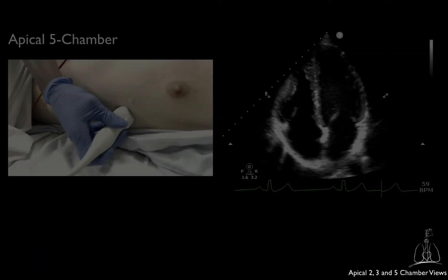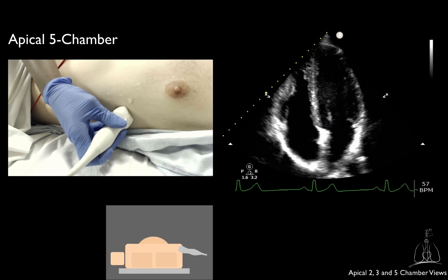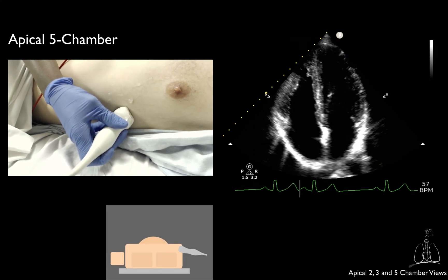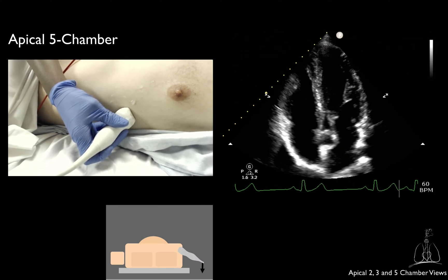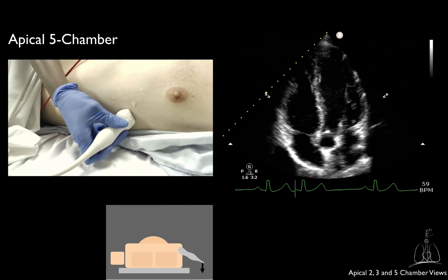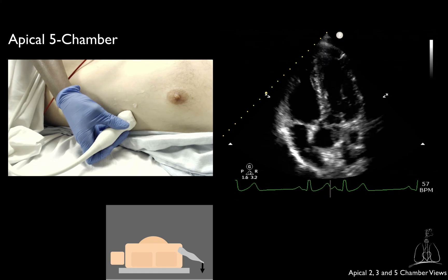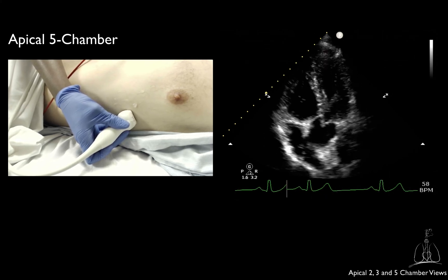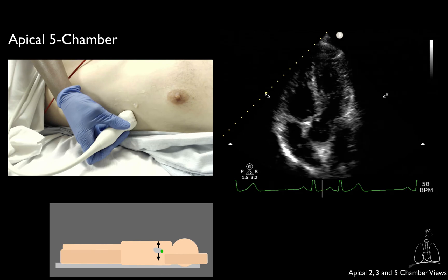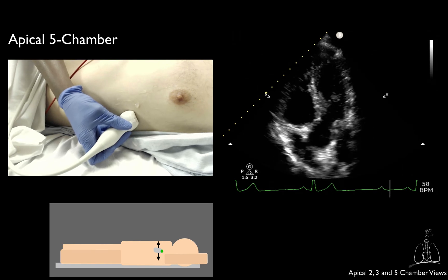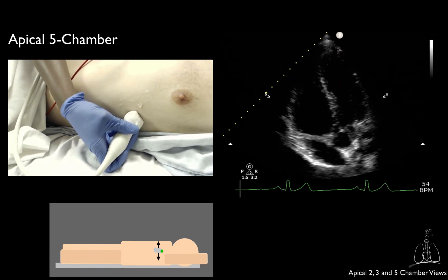To obtain the apical 5 chamber view, start from the apical 4 chamber view and tilt the tail down. To obtain a better alignment for Doppler measurement through the LVOT, you may have to slide laterally or medially.